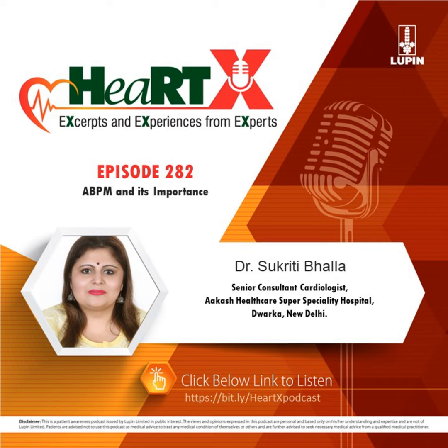So today I would be discussing ambulatory BP monitoring and its importance. Ambulatory BP monitoring provides a 24-hour account of the patient's state, and it's useful for diagnosing primary and secondary hypertension and differentiating it from the white coat and masked subtypes. It is accurate in predicting the risk of cardiovascular disease and mortality.